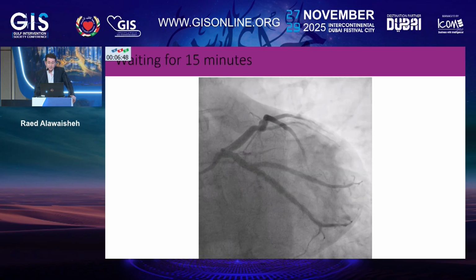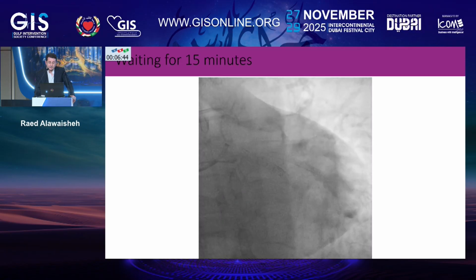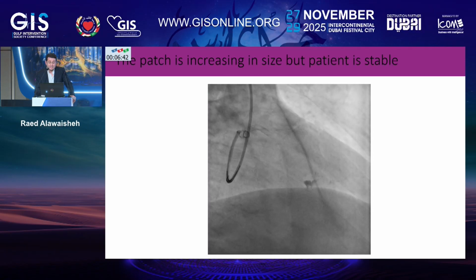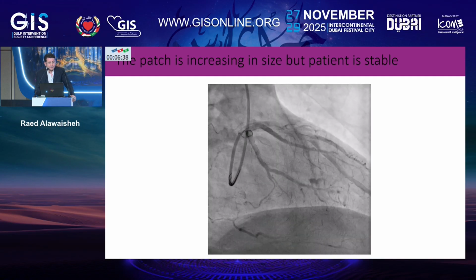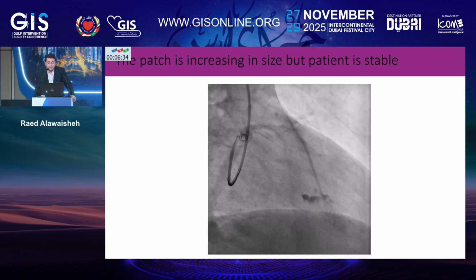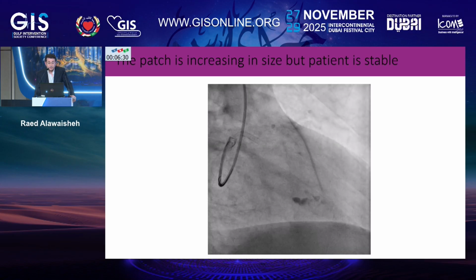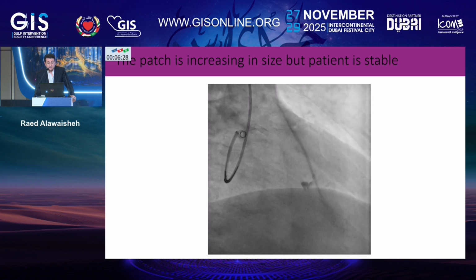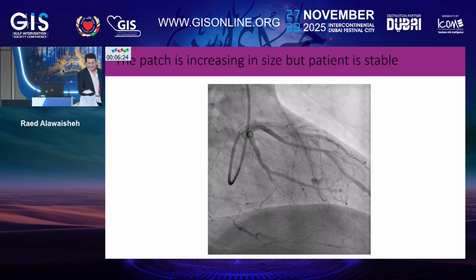So it was my concern, and I looked for a perforation, a wire exit perf. It's clear now that there is something there, and the stain is increasing gradually.